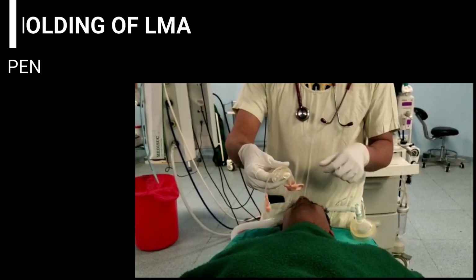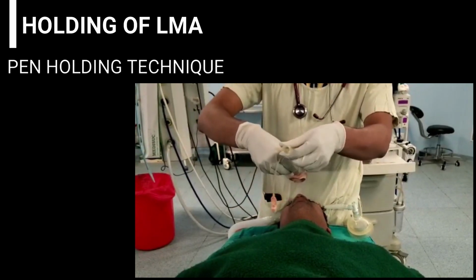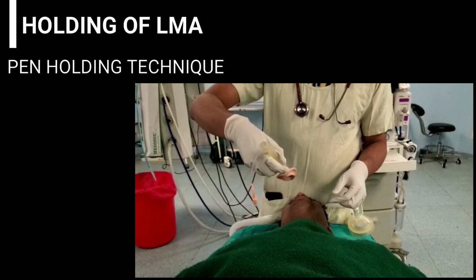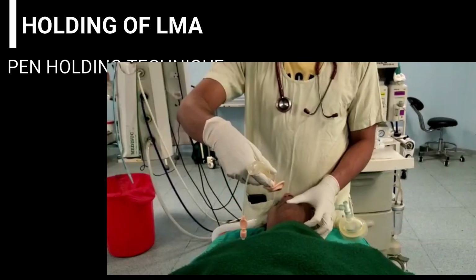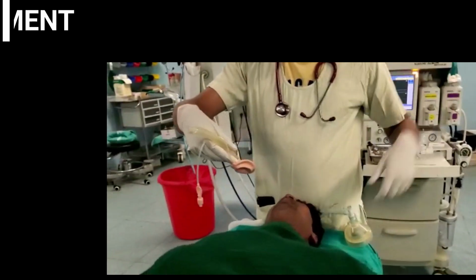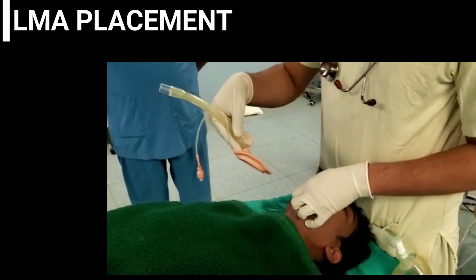The LMA should be held in a pen-like fashion with the index finger placed anteriorly at the junction of the cuff and the tube. With the help of the index finger, push the mask gently against the hard palate and backwards, maintaining the backward pressure against the posterior pharyngeal wall, and fully insert the index finger for complete insertion.